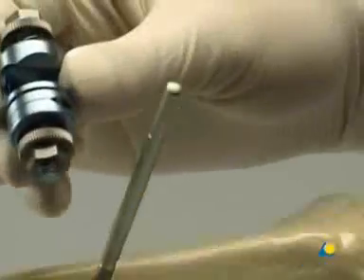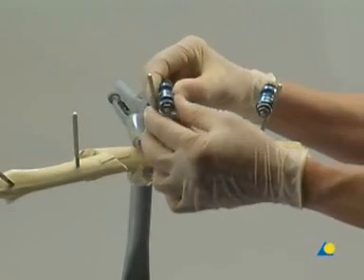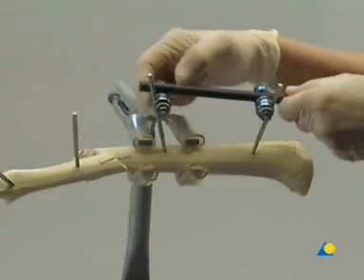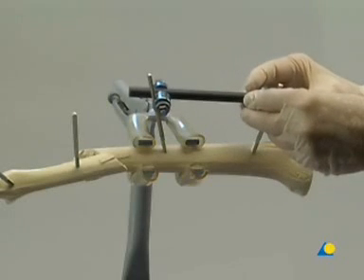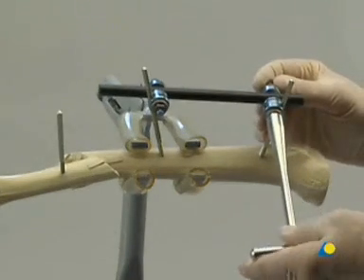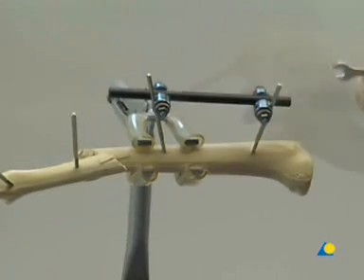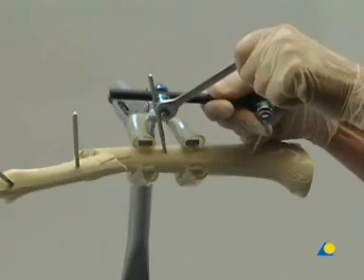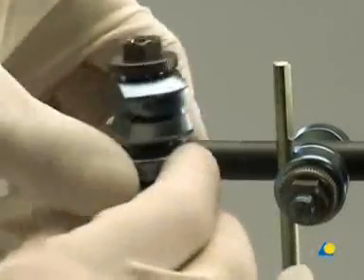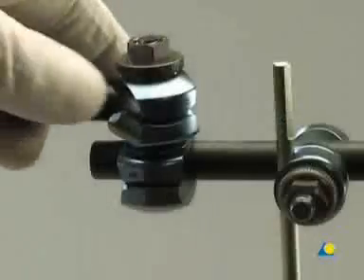The large open adjustable clamps connect the Schanz screws in each main fragment to a carbon fiber rod. The nuts on the large adjustable clamps are initially tightened by hand. The 11 mm socket wrench is then used for provisional tightening, and the combination wrench is used for final tightening. The rod ends of the two fragments nearest the fracture are connected to a third rod using one large combination clamp for each fragment. The nuts of the combination clamps are not yet tightened.